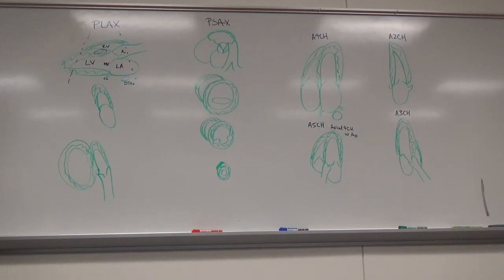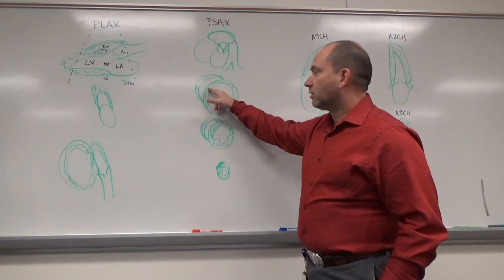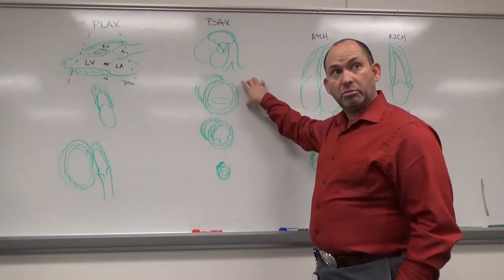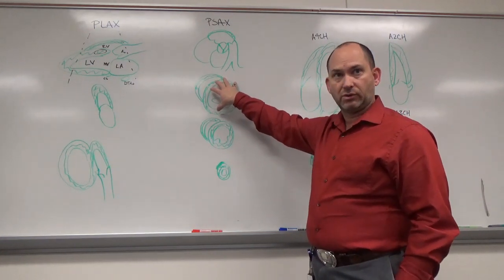In the septum, we're going to divide kind of across like this. This is going to be inferior septum, that's going to be anterior septum. This level is base, it's around the mitral valve, but I'm seeing the base of the muscle.